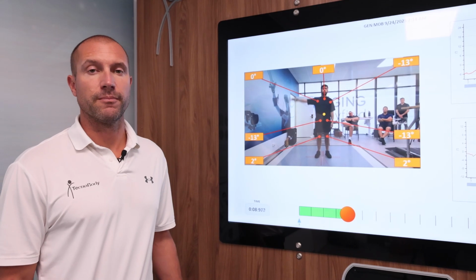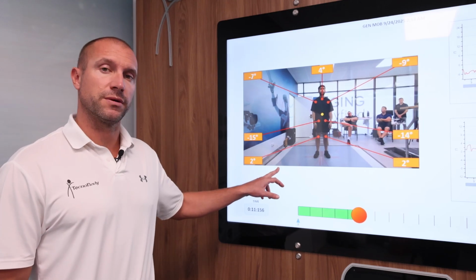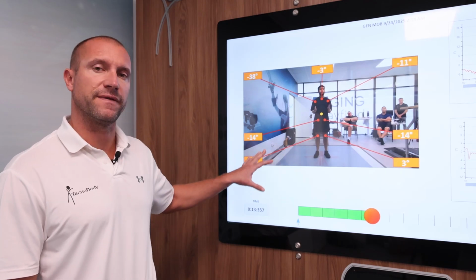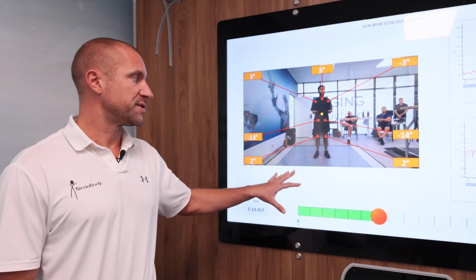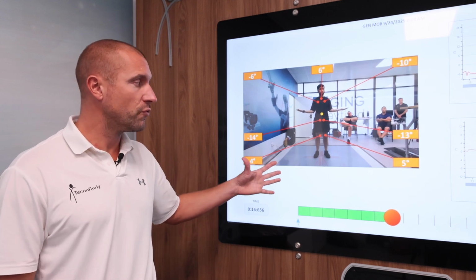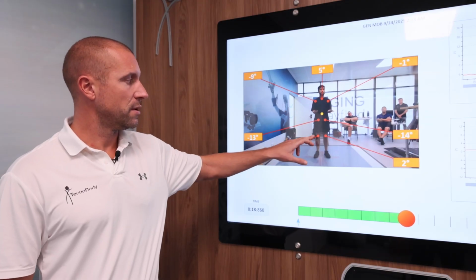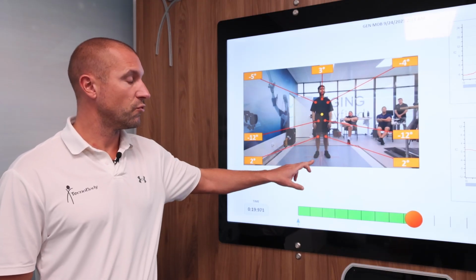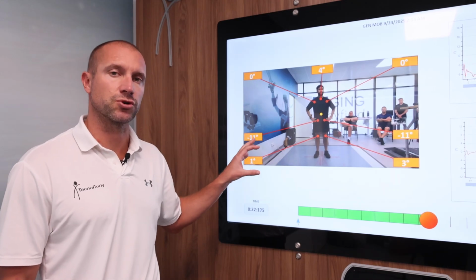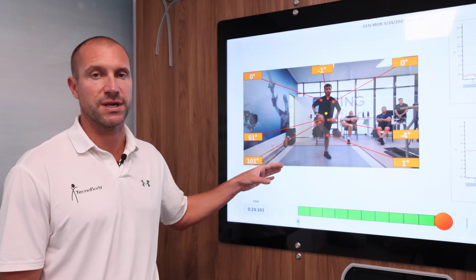After completing the motion analysis assessment, we have the possibility to rewatch the video on the big screen, and according to the different movement we can activate the different range of motion. In this case we can test movement and range of motion for all kinds of joints, starting from the shoulders, hips, knees or a general movement. We can select or deselect the range of motion by the small touch screen according to the movement or to the joint that we want to investigate.